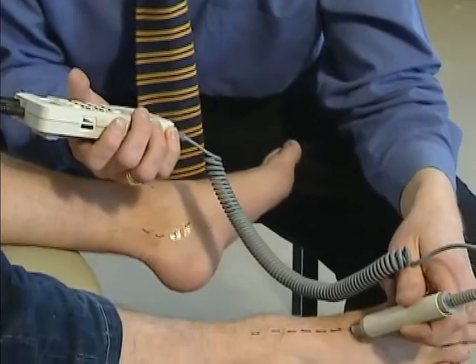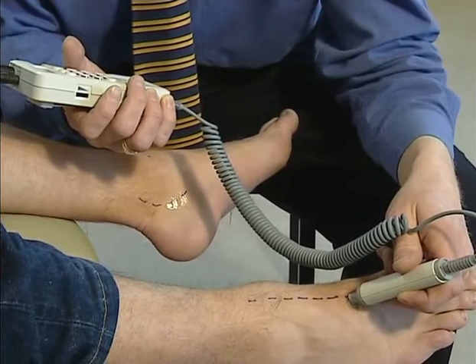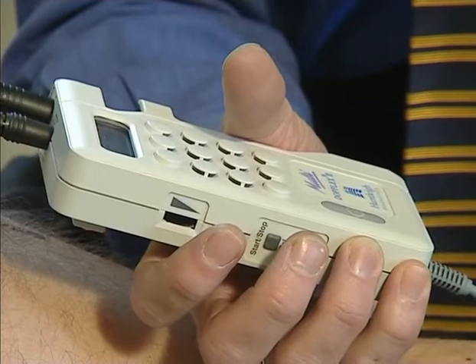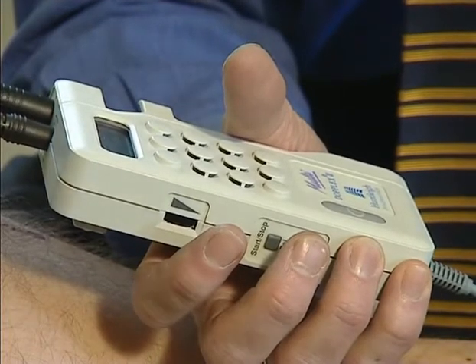The patient has normal sensation and can therefore feel all neurological tests. Normal Doppler signals can be heard and are typically triphasic in nature.